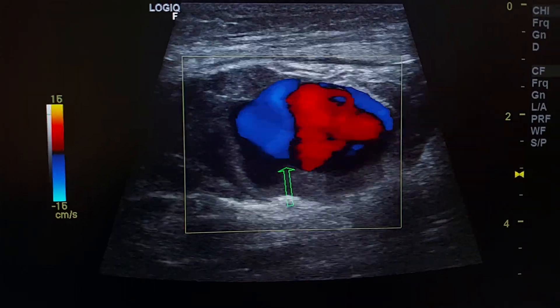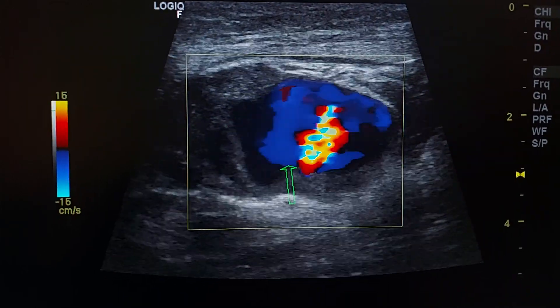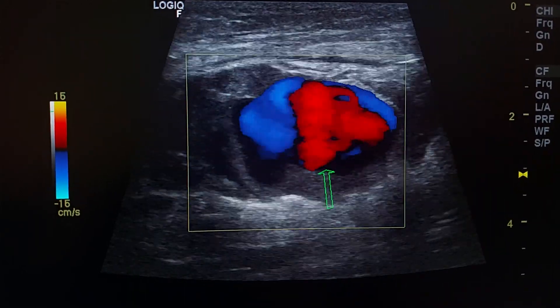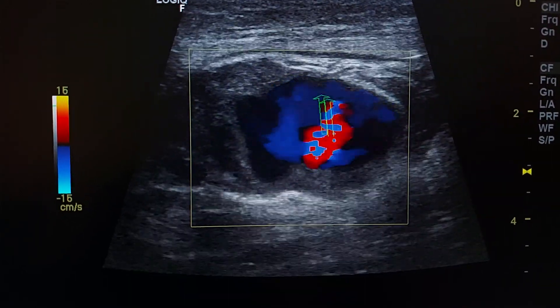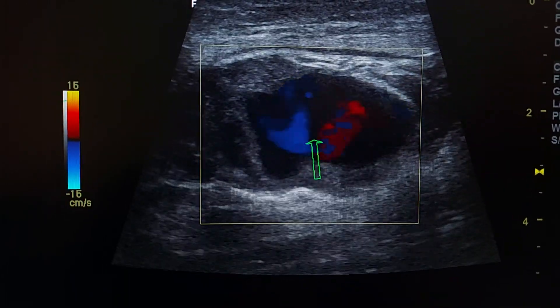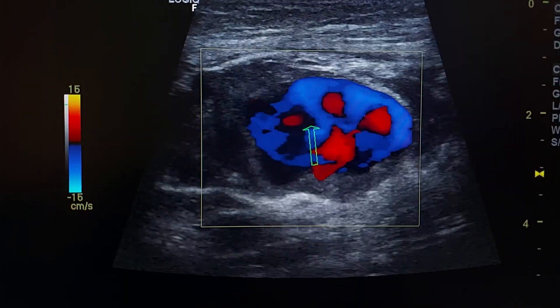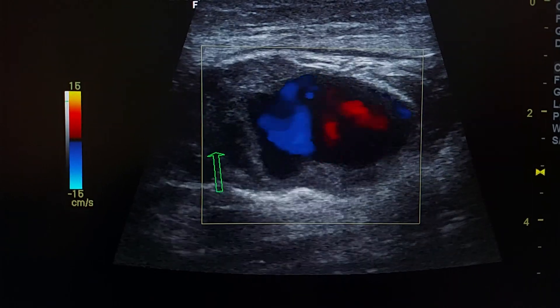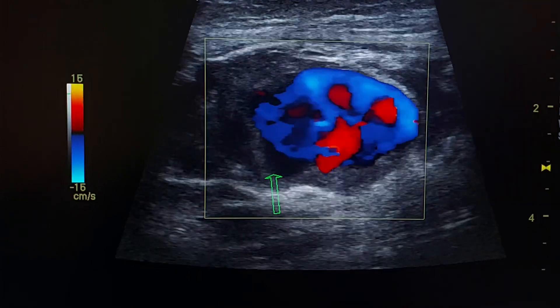By color Doppler we see turbulent vascularity and swirling of blood inside this cystic lesion. This is the mural thrombus.